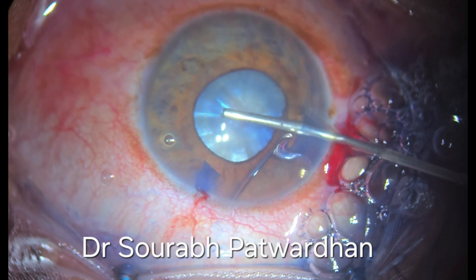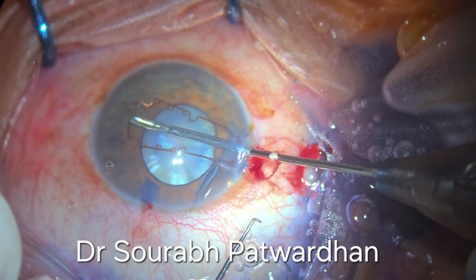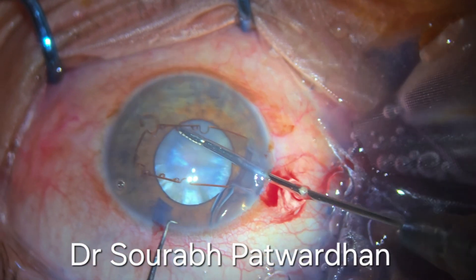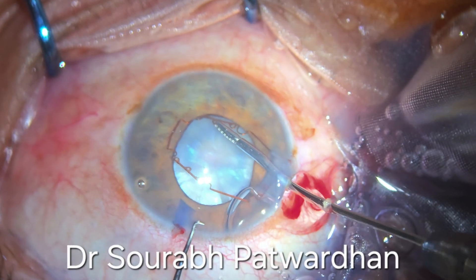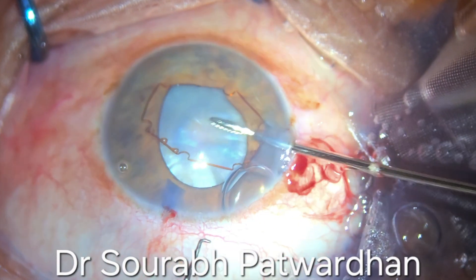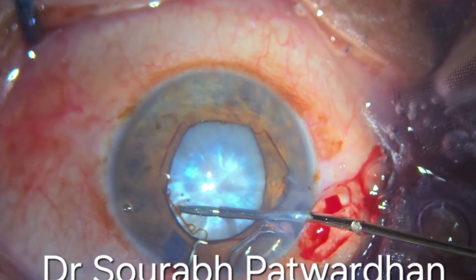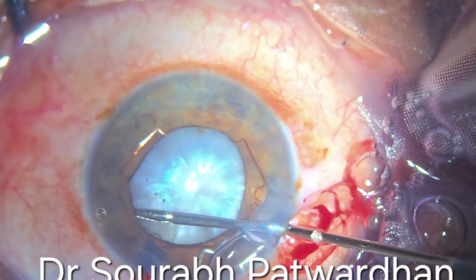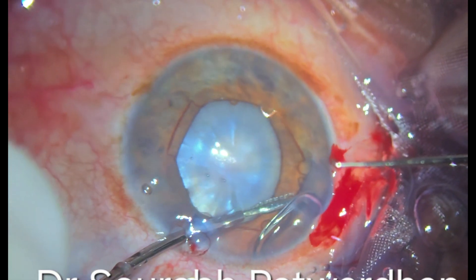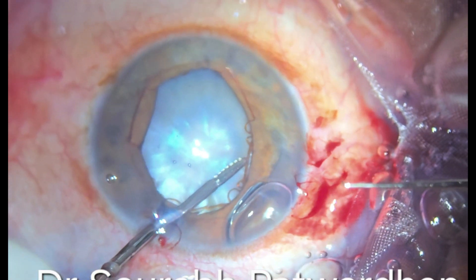Otherwise in such cases if the fluid or dye is trapped under the iris, it may cause prolapse of the iris through the incision. As the pupil is not dilating well, I am going to use a B-hex pupil expansion device here. It is made up of polyimide, very thin profile. So even in a shallow anterior chamber it can be easily used and maneuvered by these specially made vertical forceps. The important thing is to hold these flanges by the tip of the forceps so you have better maneuverability and can push the flanges under the iris.